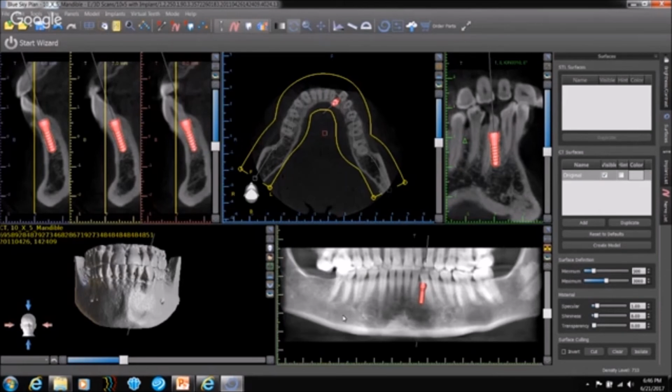Okay. Can you speak a bit about the accessory foramen, and are they all necessary to avoid with implant placement? Okay, the accessory foramens, like I said, the literature indicates a presence of probably 30, 32, 33% of individuals could happen to have accessory foramens. Now, that said, I haven't come across too many of them, although the literature indicates a high number, but it is good to know. It is good to know because accessory foramens sometimes end up.